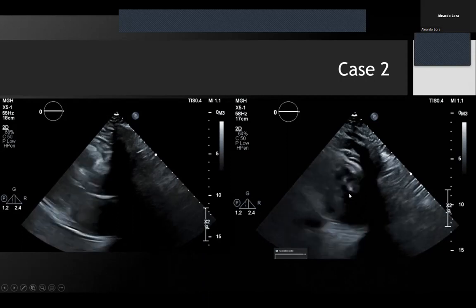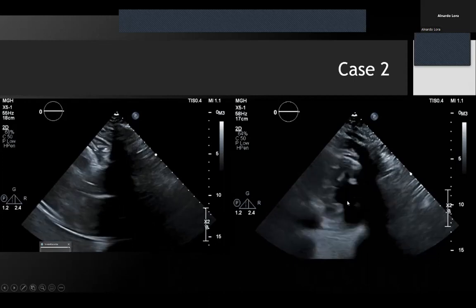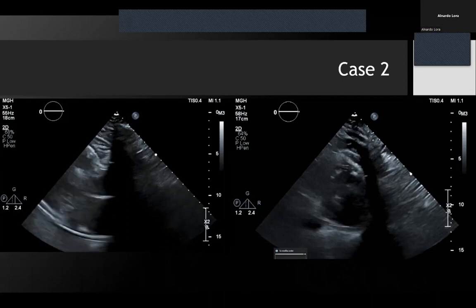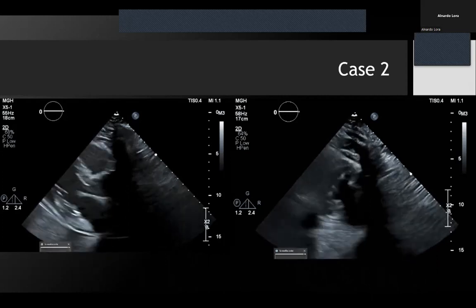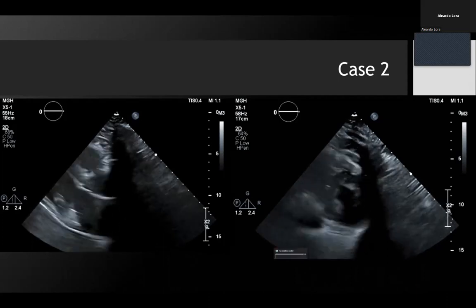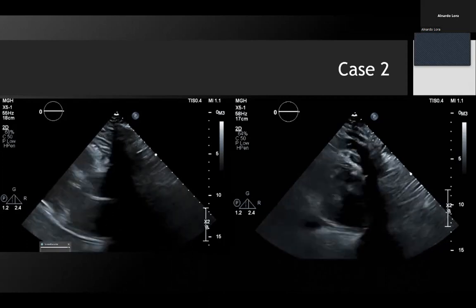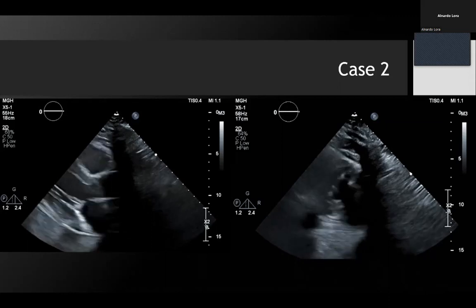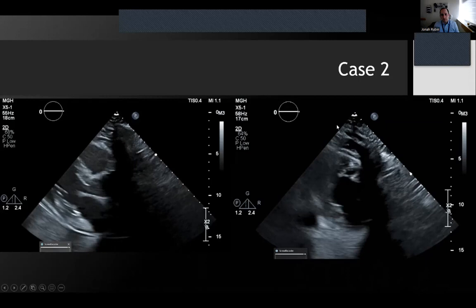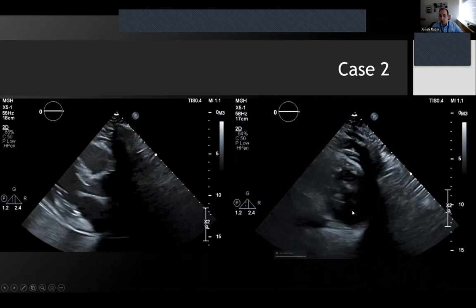And then the short axis view on the right, it seems to be almost at papillary level, maybe a little bit more towards the apex, but there we're seeing myocardial excursion as well as myocardial thickening on systole. So I would say the patient does have a pretty normal EF. I don't see any hypokinesis of any of the regions either. Yeah, that's awesome. Thank you. That was great. You might even say the fractional area change here is almost 100%.